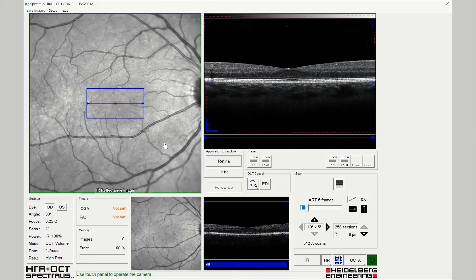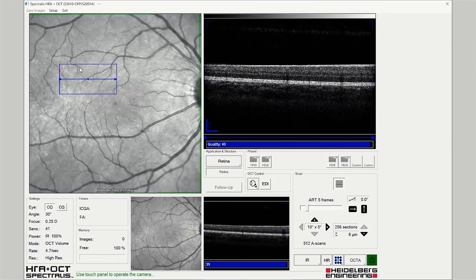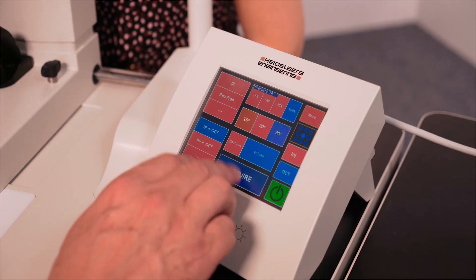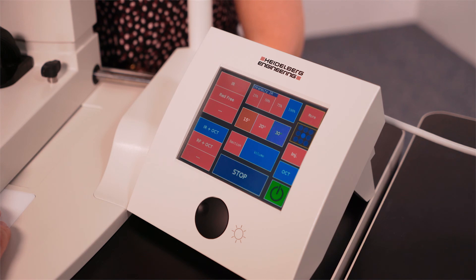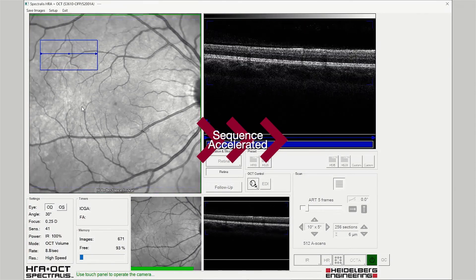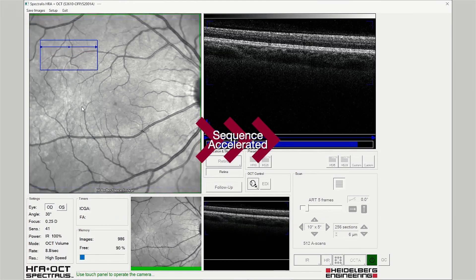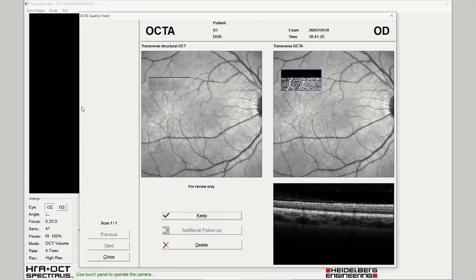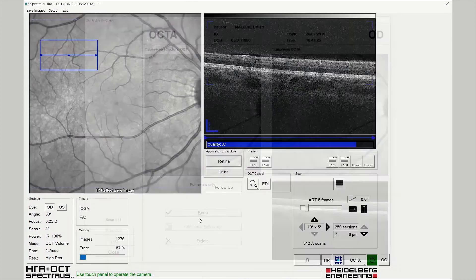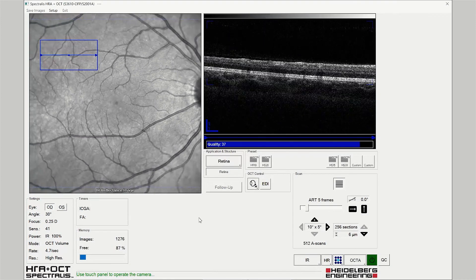Drag the scan pattern to the desired area and acquire the image, instructing the patient to blink frequently throughout the examination to refresh the tear film. The OCTA scan pattern should be reviewed in the quality control page and kept if of acceptable quality. Additional scans may be required if necessary.